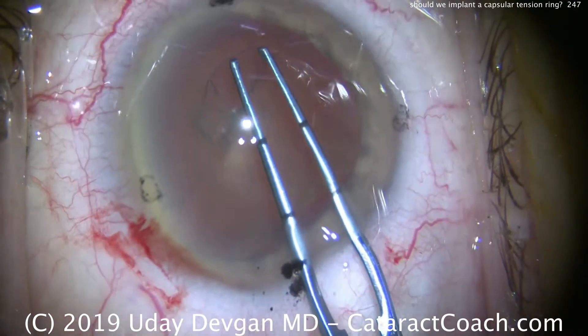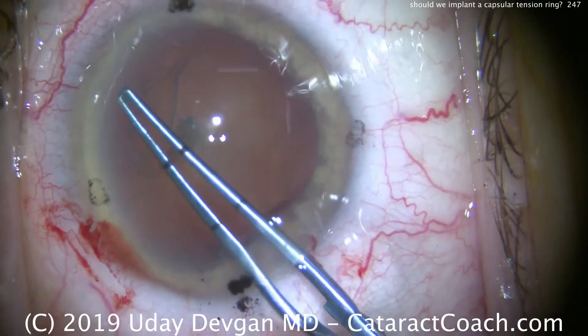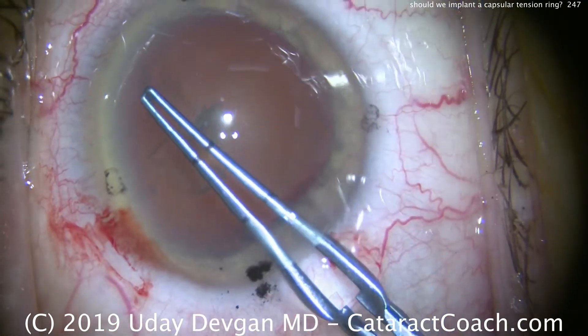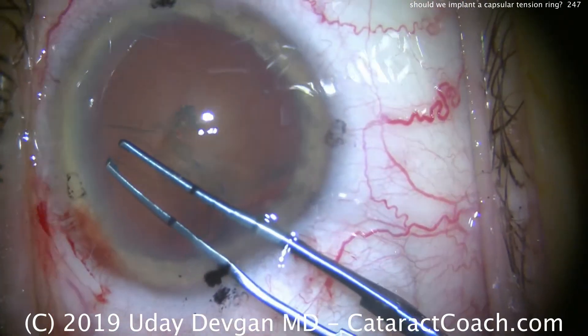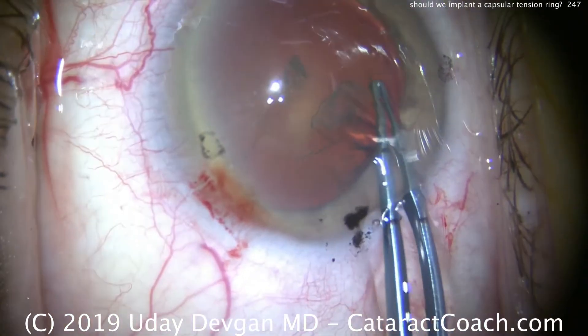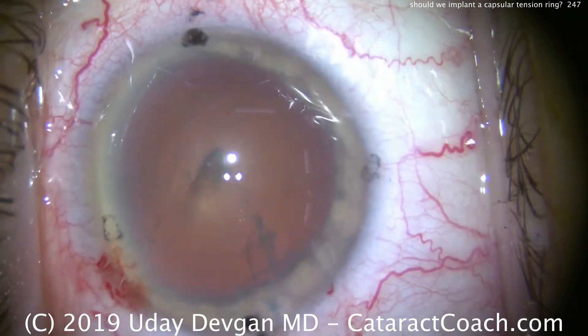So we're creating our capsulorrhexis, and there is enough tension in the zonules to hold the lens still, so we can achieve this round capsulorrhexis. They're focally normal in all the different spots, there is no trauma, but globally the zonules are all a bit on the weak side. So we created a nice round capsulorrhexis.